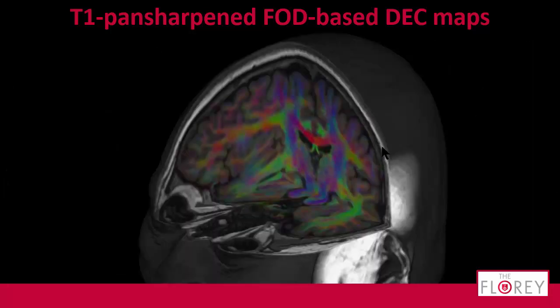Again, MRtrix. This can be done interactively. Very cool, new feature. So basically 3 planes cutting through. It's a bit easier if it would be animated, but it's not, sorry. But, well, the colors are just splashed on there. And you do keep the context as well, because I only splash them on there in a mask of my diffusion data. And all the rest of the intensities are perfectly retained.